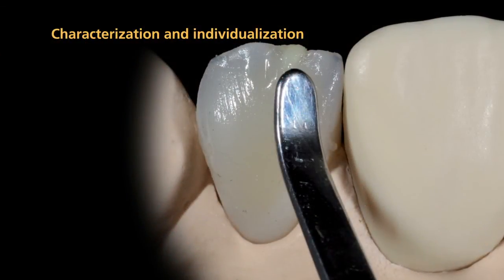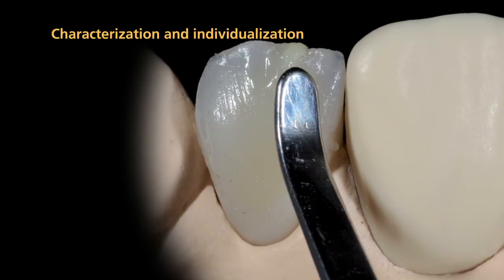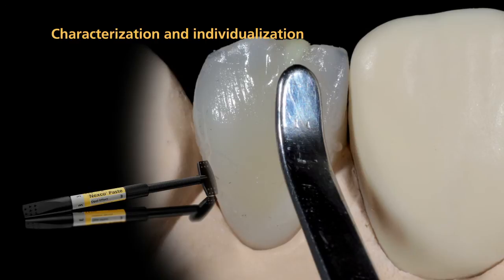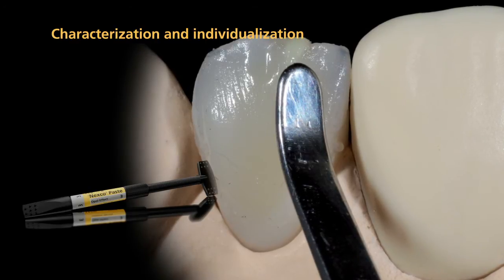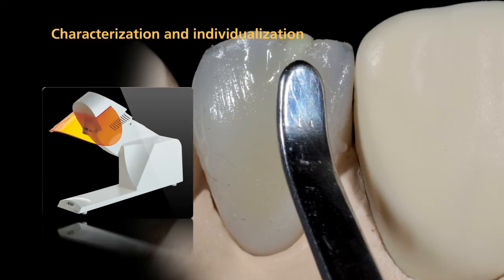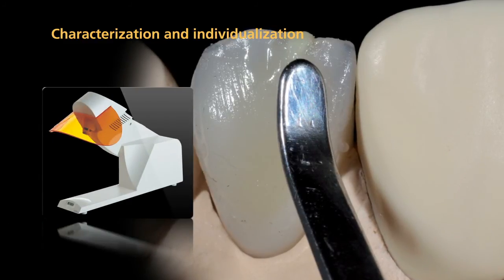You are now ready to characterize or individualize the dentured tooth. Use effect materials for this purpose. Adjust the shape and shade as desired. Pre-cure the effect materials with the quick pre-curing light.